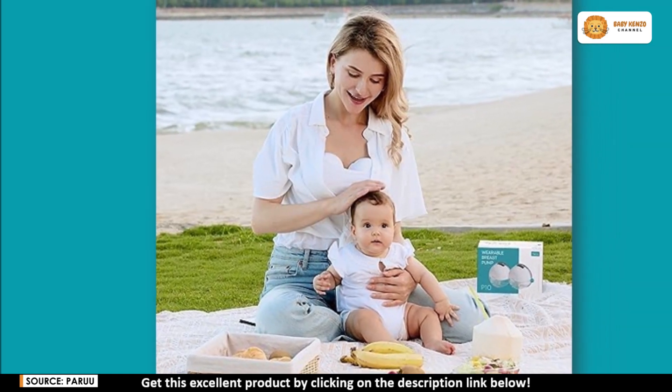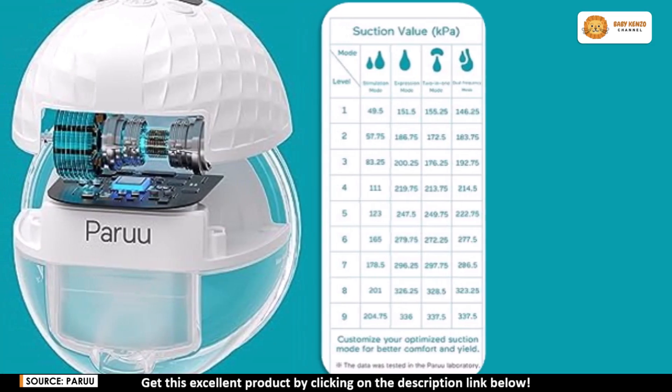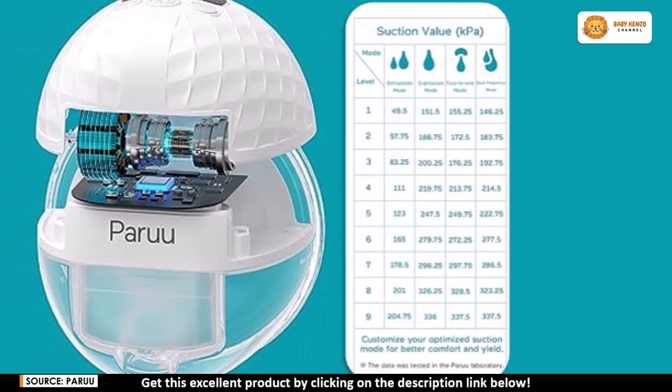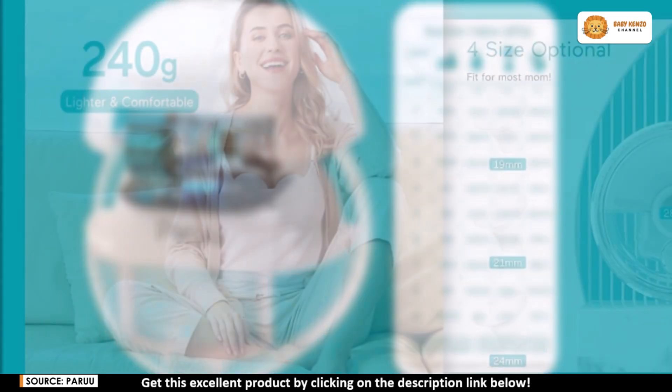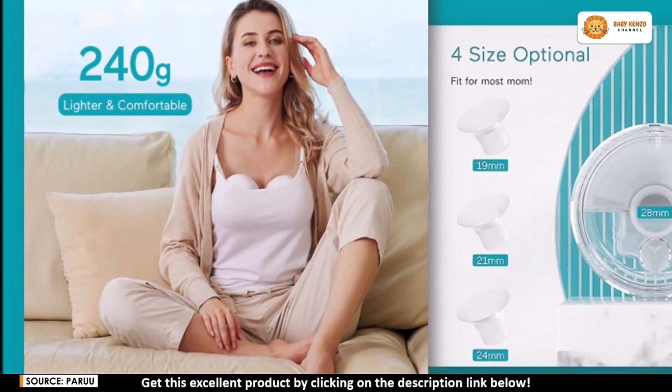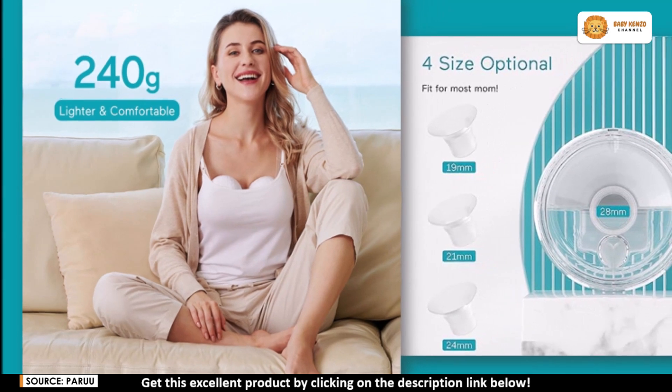Comfort is key with the Peru P10, and that's why it includes multiple flange sizes — 19, 21, 24, and 28 millimeters — to ensure a snug, perfect fit for most moms. With the included size guide, finding your ideal fit is easy, which means you'll pump more effectively without any discomfort. Weighing just 240 grams, the Peru P10 is small, discreet, and comfortable enough to wear throughout the day without feeling bulky.